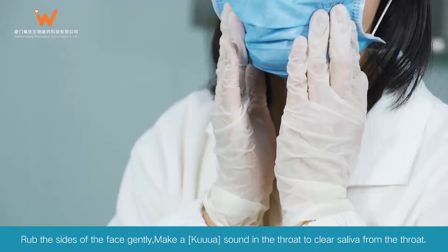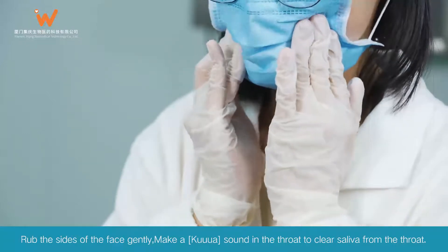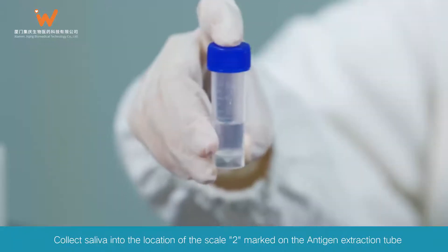Sample Collection: Rub the sides of the face gently, make a sound in the throat to clear saliva from the throat. Collect saliva into the location of the scale 2 mark on the antigen extraction tube.